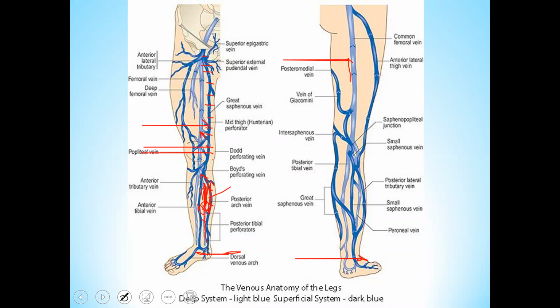For taking blood flow from the arterial system, for example, you have taken the velocities and flow pattern of the femoral artery at the inguinal region by rotating the transducer and achieving a Doppler angle of less than 60 degrees. You take the velocimetry.